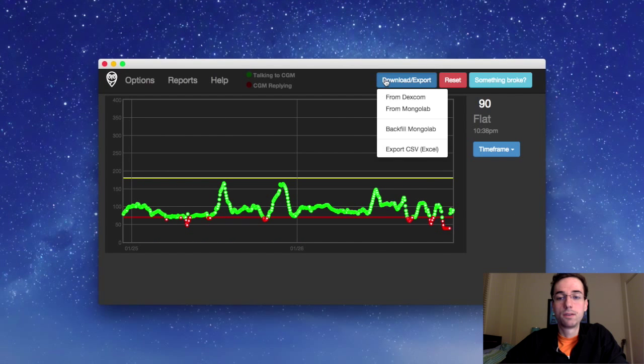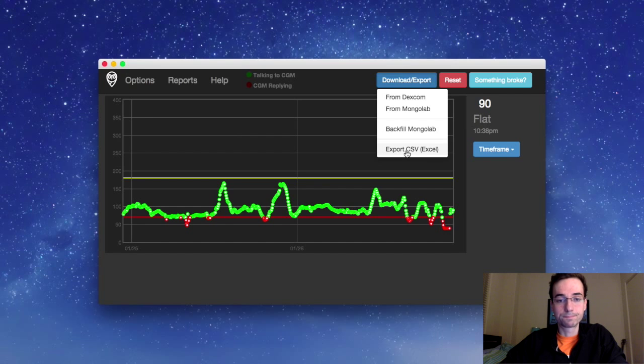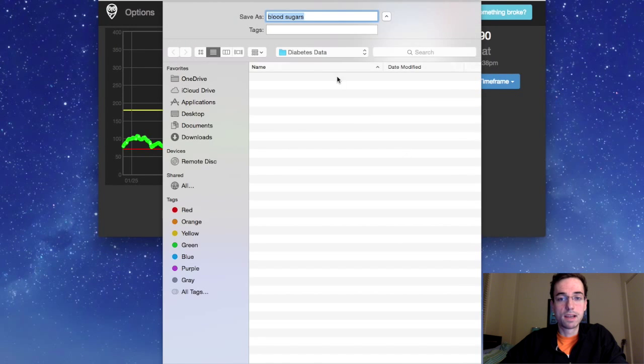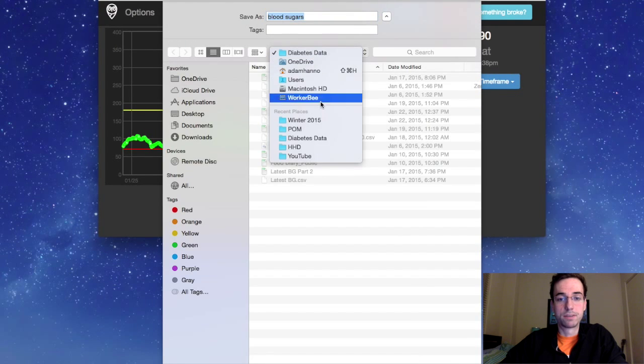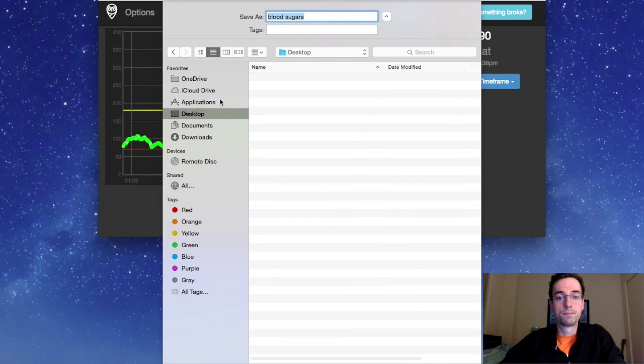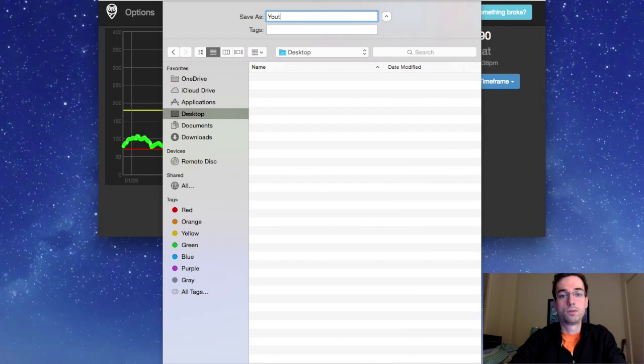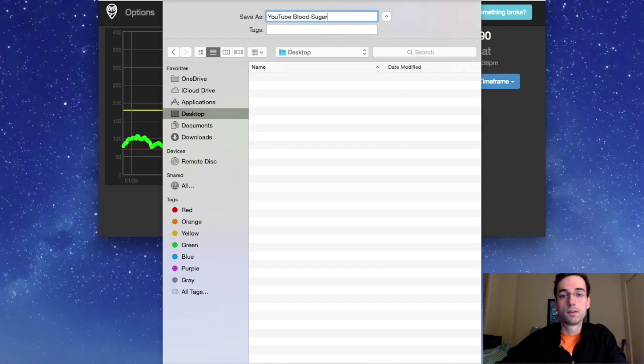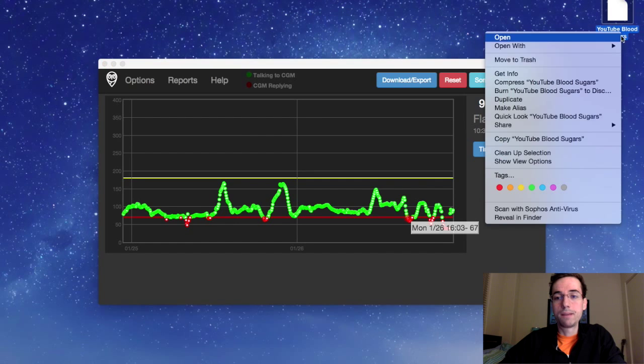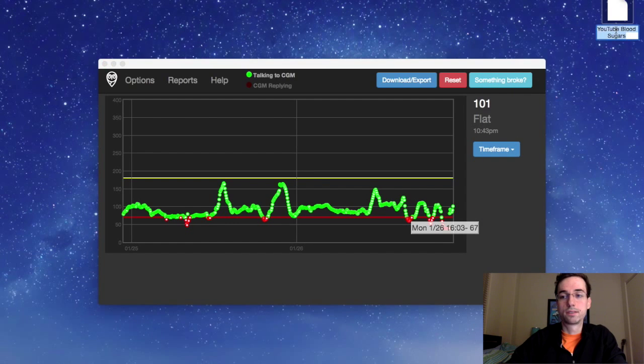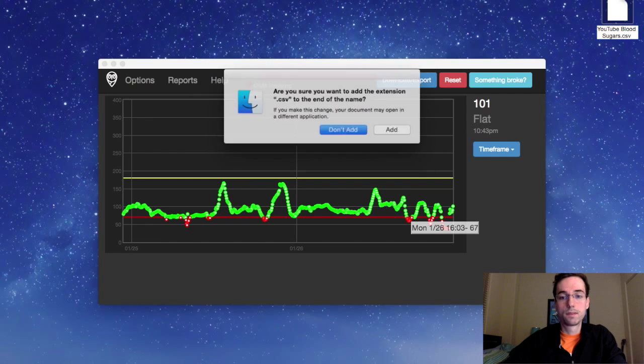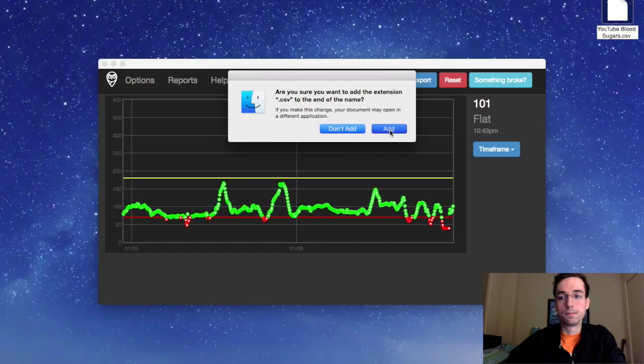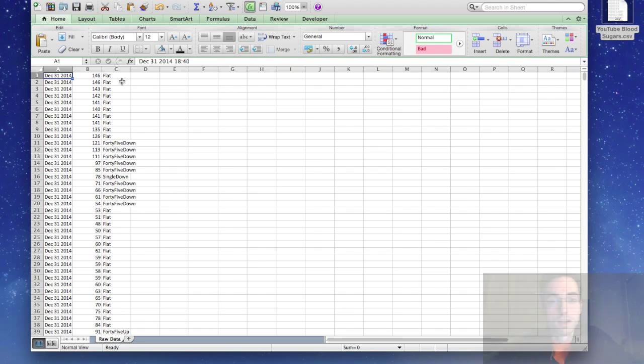Go to download and download export CSV. And I'll just save it for now. I'll just save it to my desktop. And on my Mac, I actually have to rename the file. You might have to do this. So I have to rename it .csv. Add the extension so it'll be recognized as a Microsoft file.